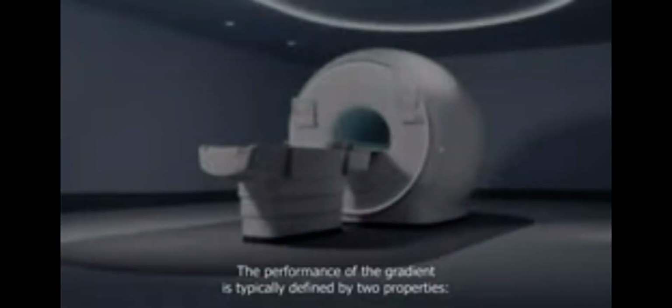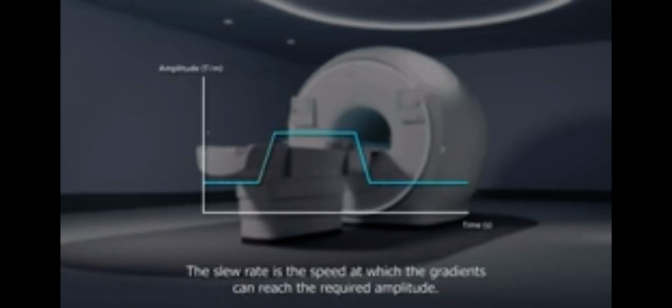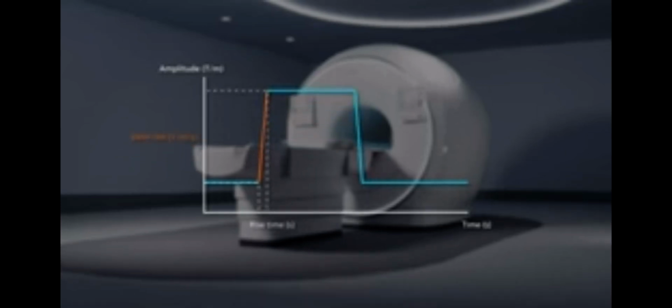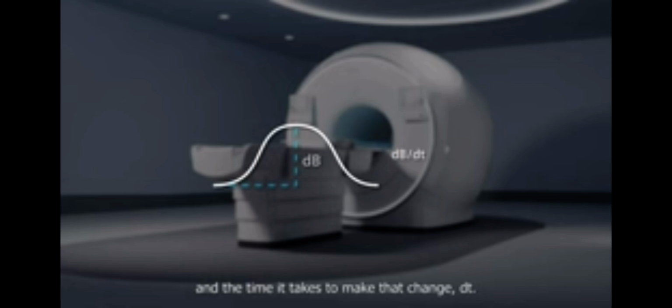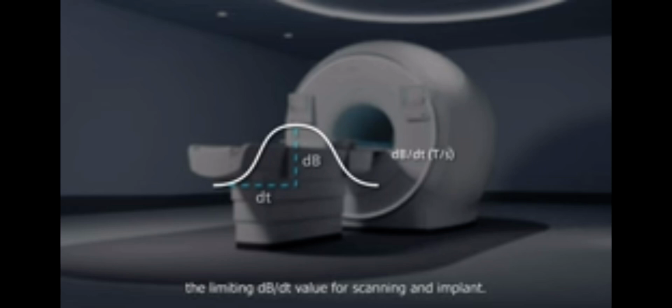The performance of the gradients is typically defined by 2 properties: the amplitude of the gradient magnetic field and the slew rate. The slew rate is the speed at which the gradients can reach the required amplitude. The time it takes to reach the required amplitude is called the rise time. Higher slew rates are louder. dB/dt is the ratio between the change in amplitude of the magnetic field, dB, and the time it takes to make that change, dt. dB/dt is measured in Tesla per second, T/s. Implant manufacturers may specify the limiting dB/dt value for scanning an implant.